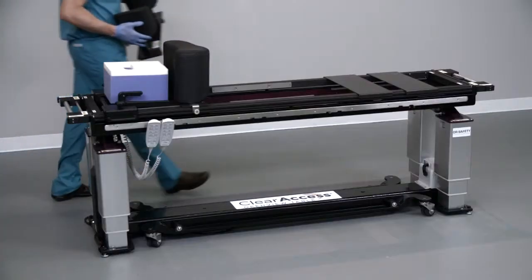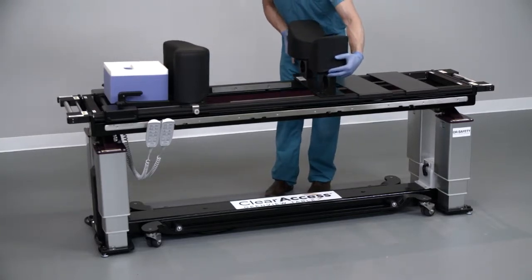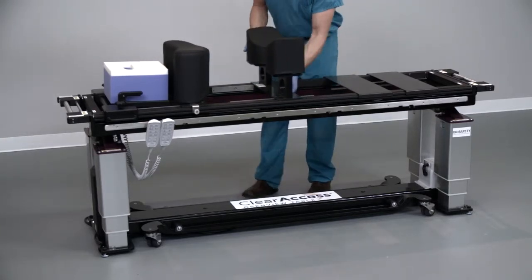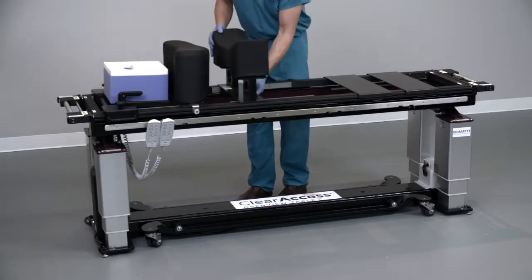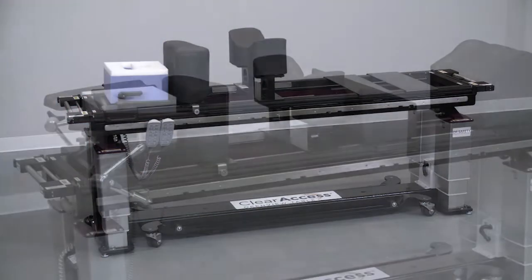Install the pelvic system of the open frame spine platform by inserting the feet toward the foot end of the table. Then slide forward to engage the inner rail. Remember to align the pads with the patient's sternum and iliac crest prior to transferring the patient onto the table.